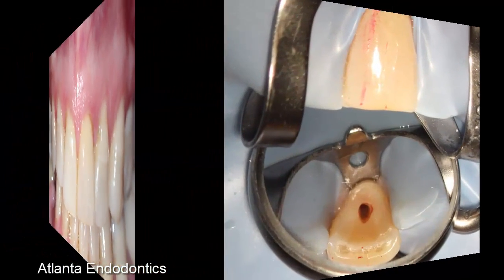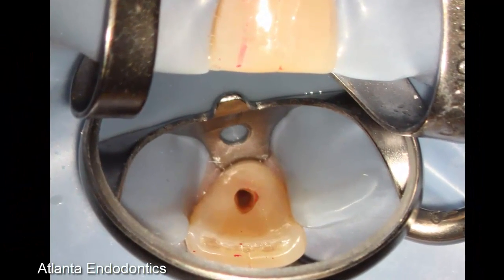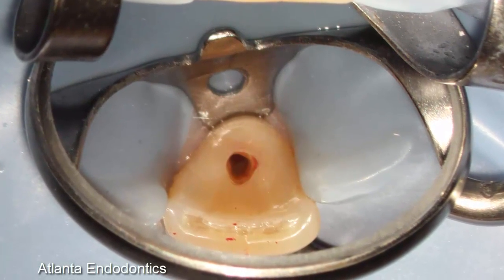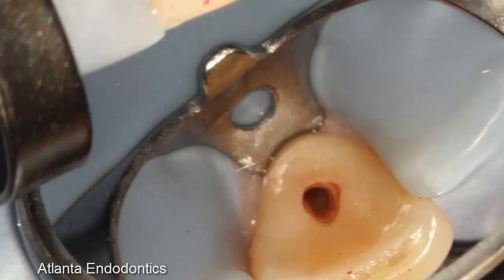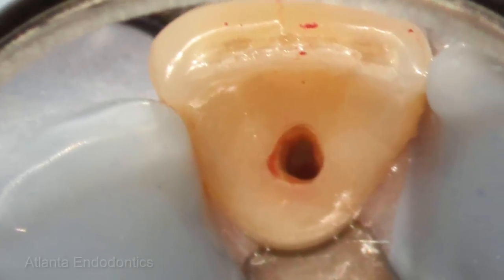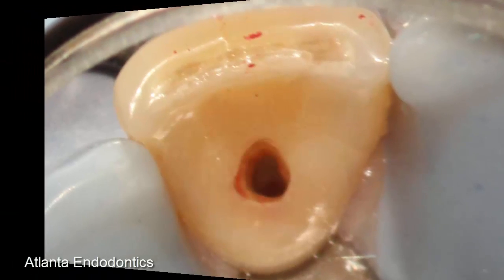So under the microscope, as we do all procedures under the microscope, we make a little opening in the back of the tooth. And what I tell my patients is that because we're dentists, we do everything upside down and backwards. This seems to give patients a little better understanding of what we do on a daily basis.